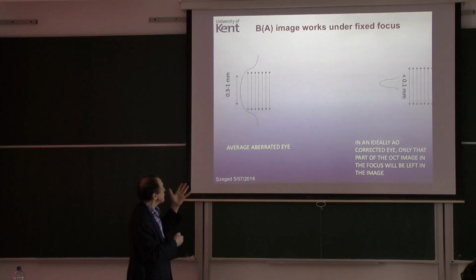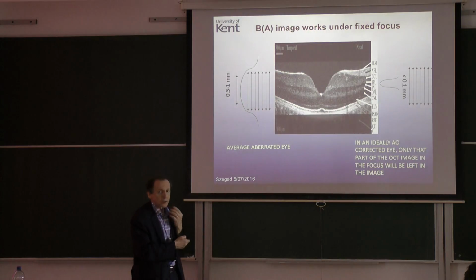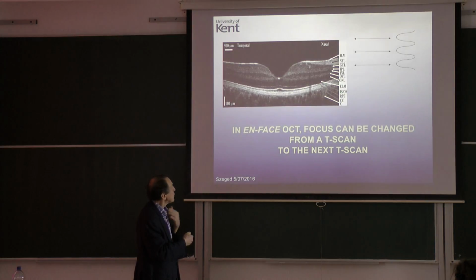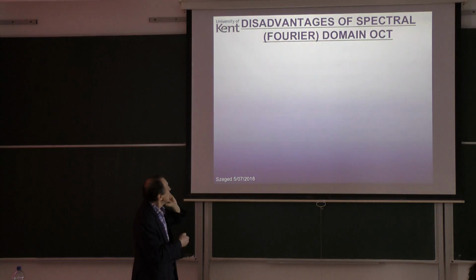But what happens in reality, as I have shown you, is an image from the eye. As you improve the adaptive optics, practically you reduce the confocal gate. You see here, this becomes narrower and narrower. So now we have to shift it axially, like with the Gabor filtering. And I'm showing there the focus profiles which you have to shift in depth to scan it well.